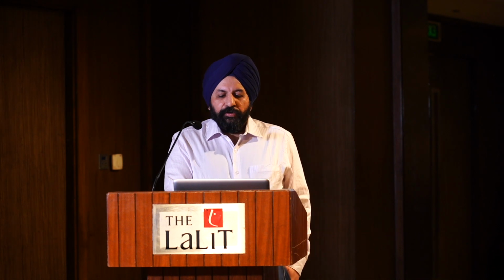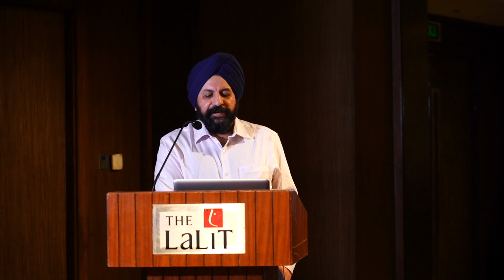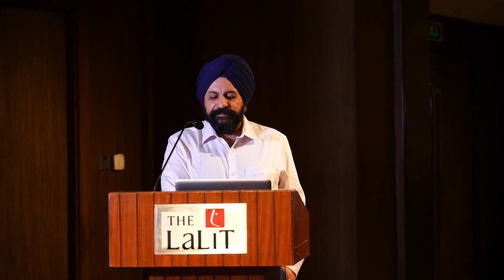So coming to optical fluorescent platelets. As you can see, there is this area of intersection of platelets and RBCs where there are large platelets as well as platelet clumps as well as fragmented RBCs and microcytic RBCs. Because of this, the impedance is problematic, but optical resolves this problem to a great extent, although with the caveat that it is not 100%.